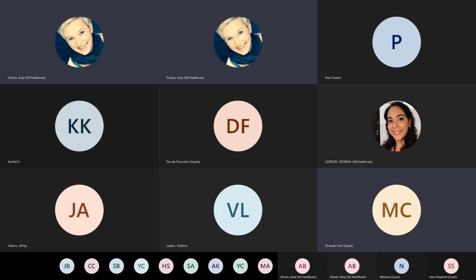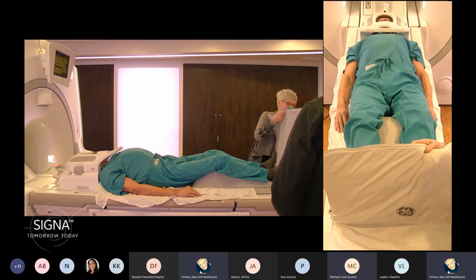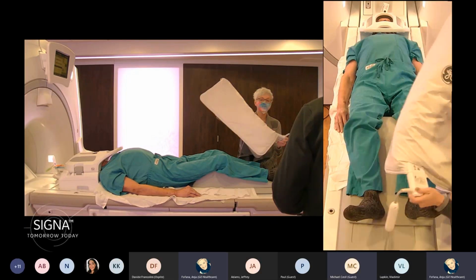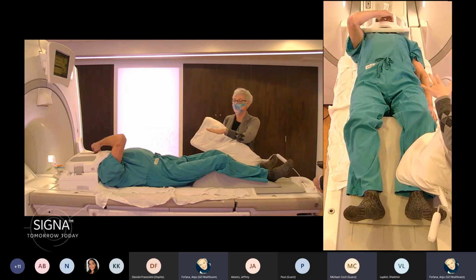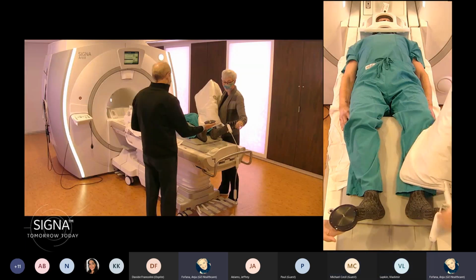And then the nice thing, even though we are going to scan the abdomen afterwards, there is no need for applying any bellows on the patient. So bellows for respiratory gating, we will use our navigator technique to do so.